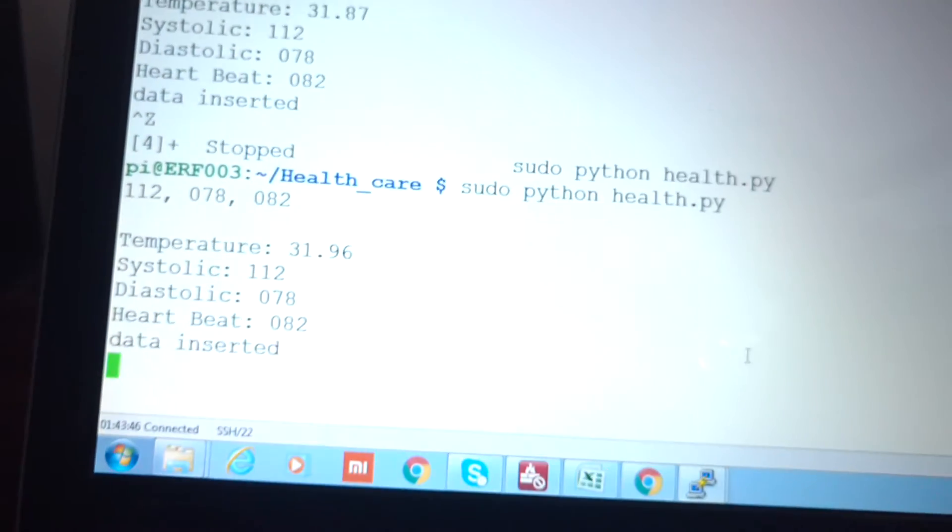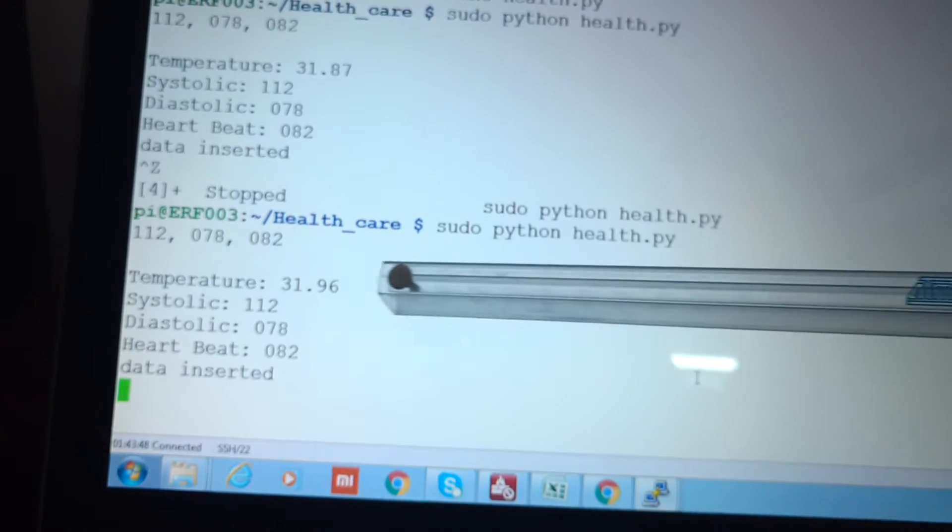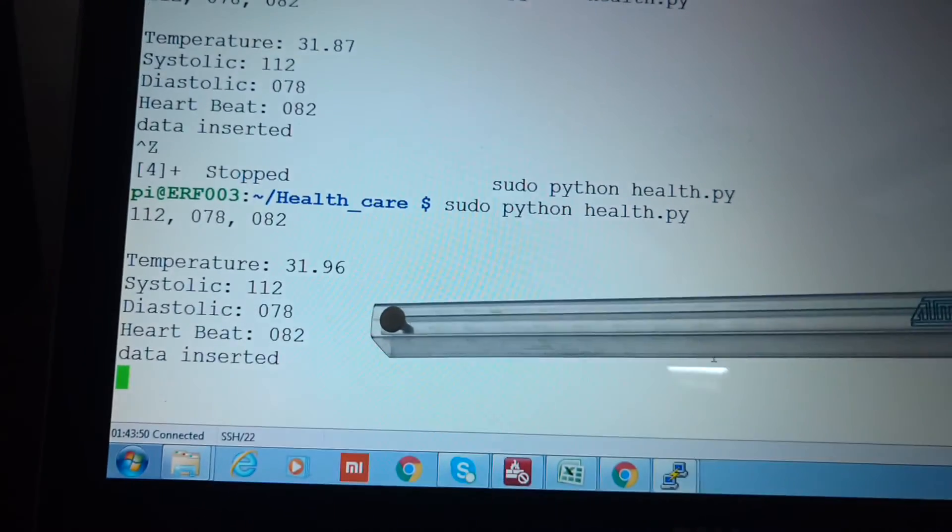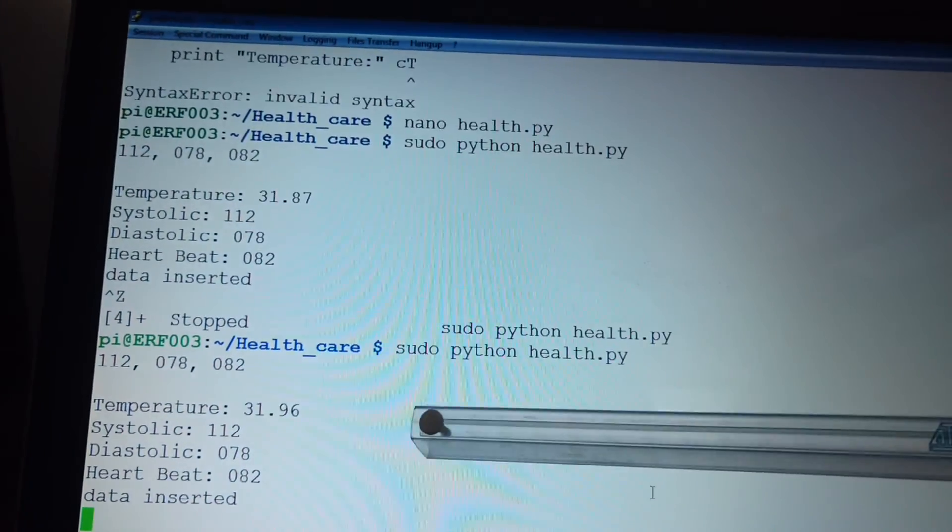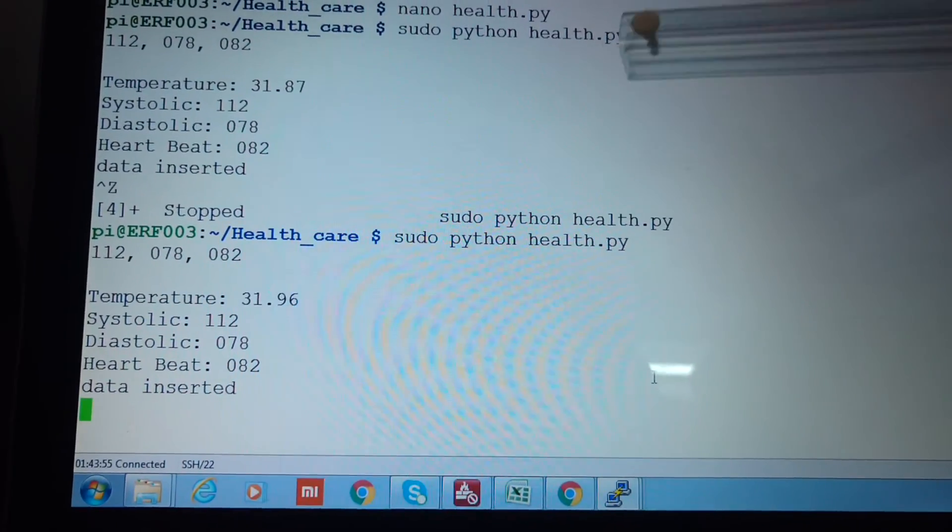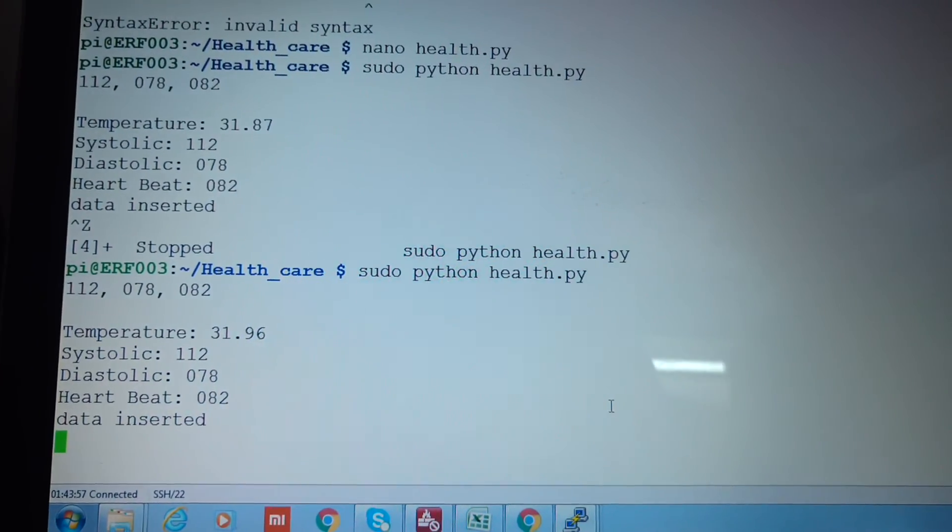We have written a code in Python language and you can see that the temperature value, systolic, diastolic, and heartbeat value is displayed here and the same value is stored in a text file which is uploaded onto the web page.